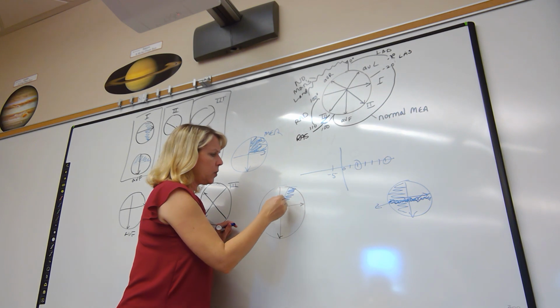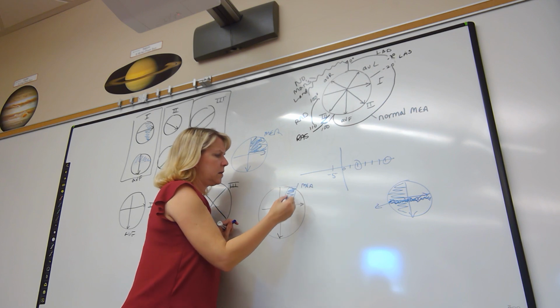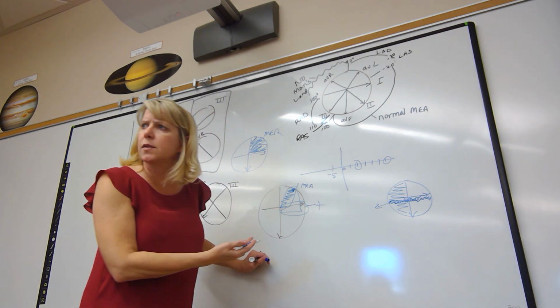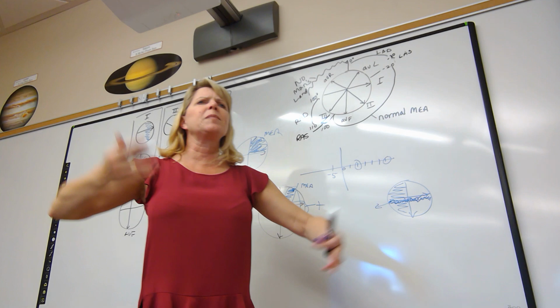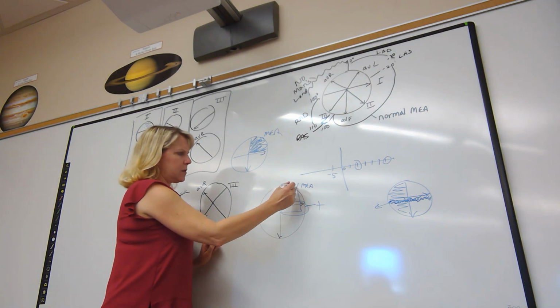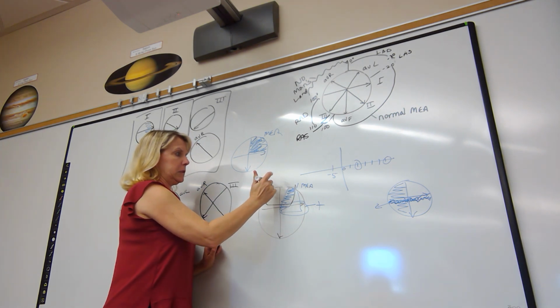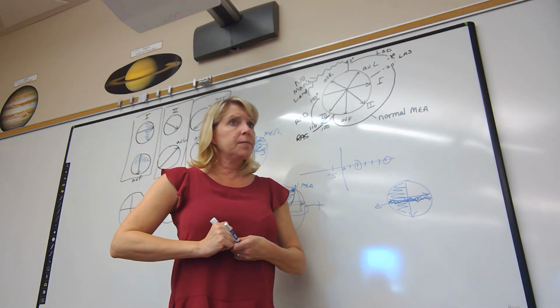Well, all you have to do is say, well, here's my MEA, and this is overall positive for lead 1. It's on the positive side, isn't it? So you would say upward deflection means positive deflection. What about for AVF? What side is this on? Negative. So you would say for AVF, overall negative deflection. Correct? Okay.